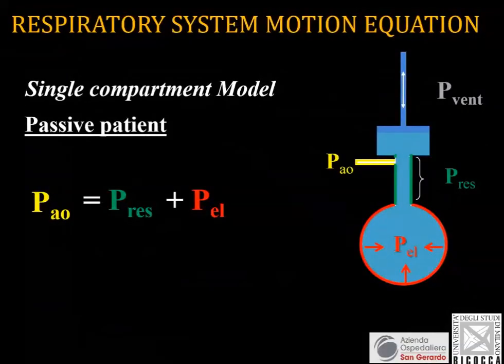Now, the interesting part, I think, of mechanical ventilation comes from the monitoring which we can achieve while we are ventilating a patient. So monitoring has one aspect, which is of course safety. We do not want our patient to blow up. We do not want the lungs of our patient to become atelectatic.